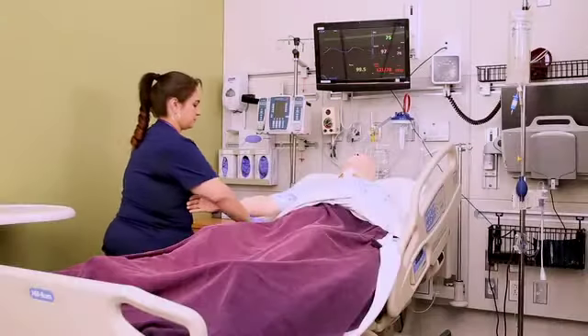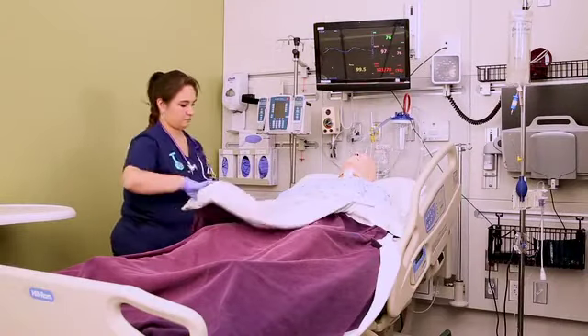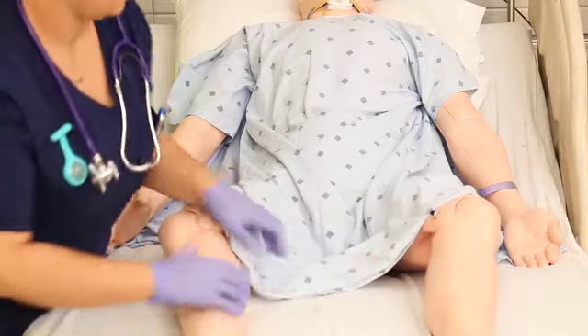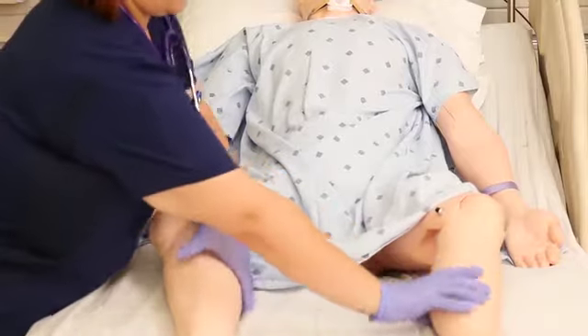The first thing you're going to do is assist the patient to an appropriate position. For males, that is supine with their legs just slightly apart so that you have room to place your supplies.